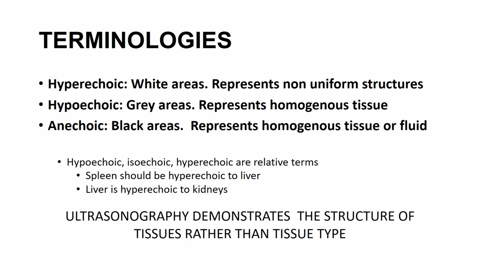Let us discuss the terminology which is used in ultrasonography. When you are interpreting any ultrasound image or ultrasonograph, you have to use terminologies like hyperechoic.